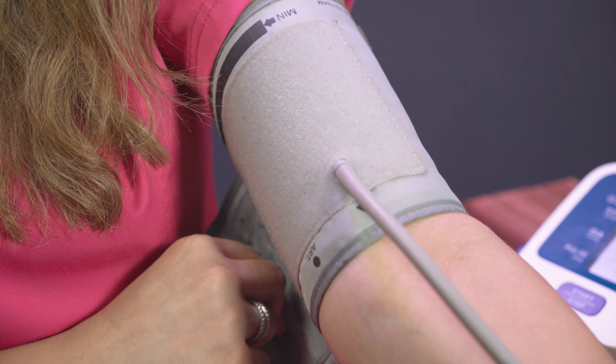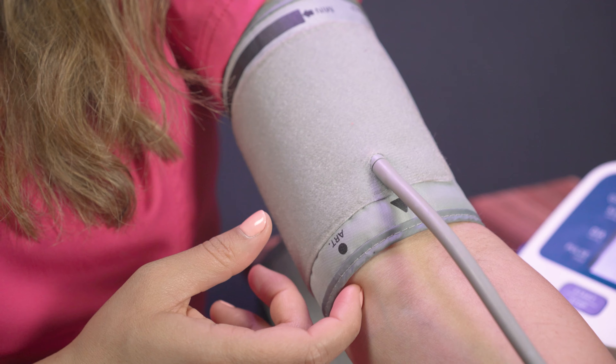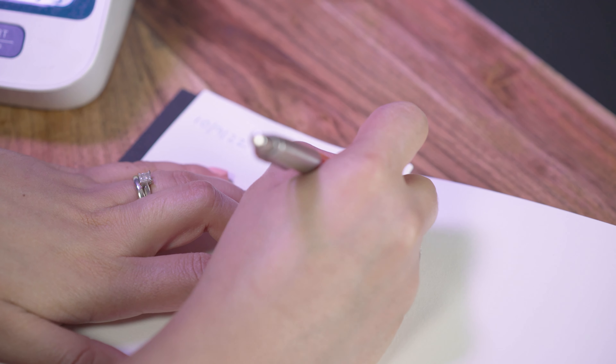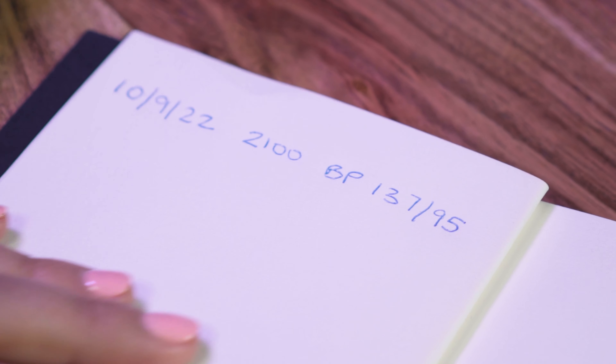Once your machine has finished, remove your cuff and record your reading. Remember to include both the higher and lower numbers in your record keeping. It is best to repeat your reading after a few minutes, as your second reading may be lower.